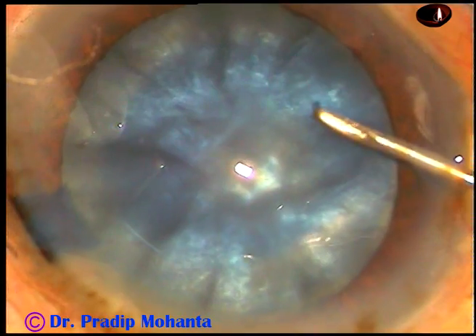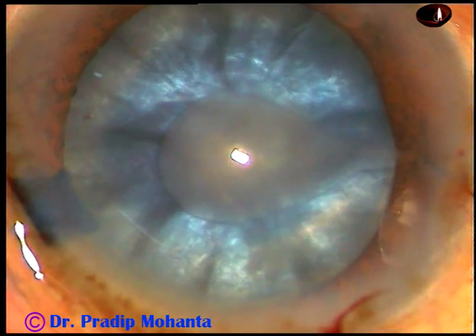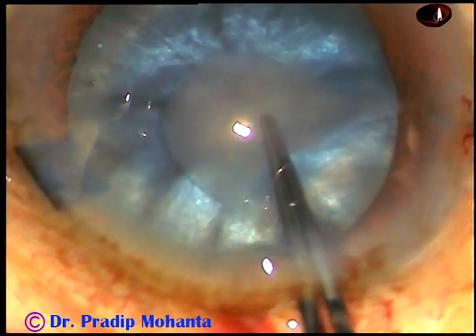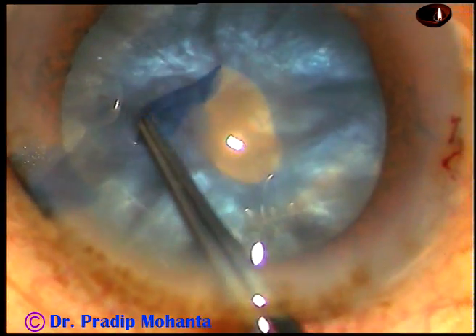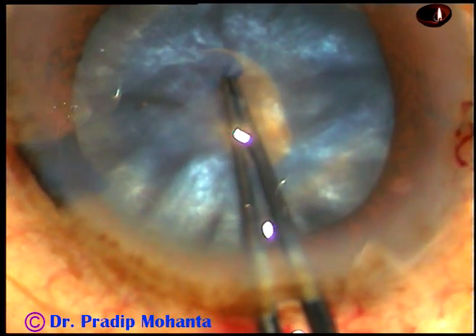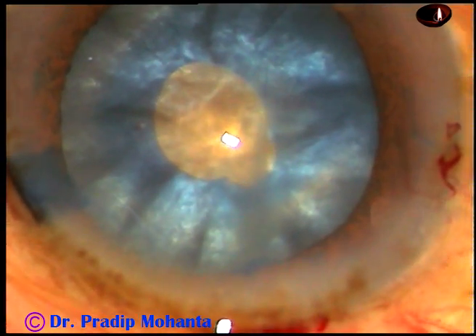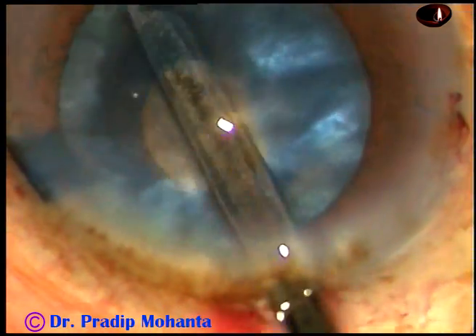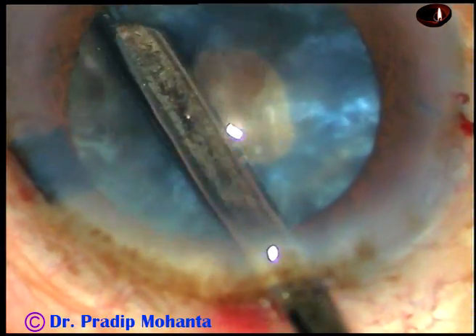And now capsulorhexis. The anterior capsule is incised and see what happens. Immediately, turbid fluid comes out, indicating high intralenticular pressure. In this case, I always do a small rexis — I call it a mini-rexis first. And through this small opening, some cortical matter is removed to decrease the intralenticular pressure.